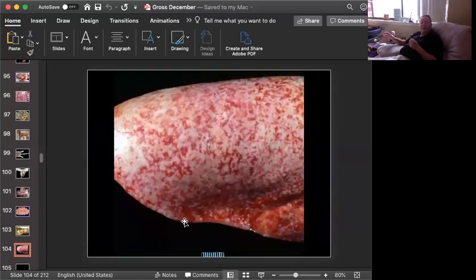And our final slide for the day is tissue from a dog. Can you give me a morphologic diagnosis and a cause? Okay, time's up. We're looking at a lung. Unfortunately, the front and the back have sort of been cut off, so it's still hard to tell. But this is a lung.